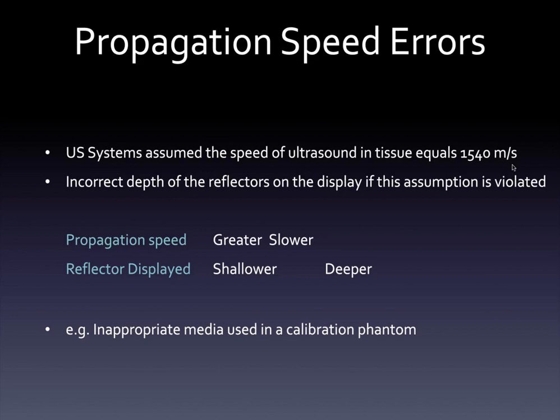Similar to the way a submarine in the Navy tries to figure out where things are in front of it, and the same as bats and dolphins, what they call echolocation, to see how far your object is. So the bats can fly in complete darkness and still get the prey, so to say.